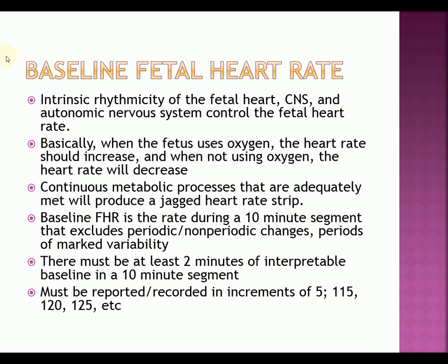So basically, just like you and I, when the fetus uses oxygen, the heart rate should increase. When not using the oxygen, the heart rate will decrease and bump along there at their baseline. So if we're chugging along at an 80 heart rate and we do some exercise and use up some oxygen, our heart rate will go up, maybe to 100 or so.